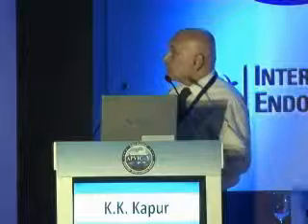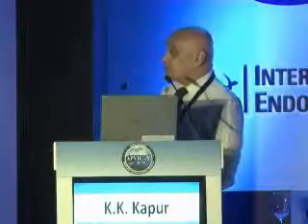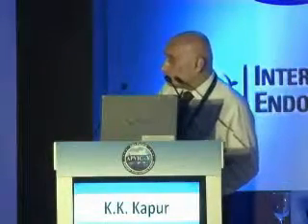is showing venous incompetence at the great saphenous vein at the junction with the common femoral vein. The saphenofemoral junction is severely incompetent. When you do that compression, you get the retrograde flow. Blue is the antegrade flow, but when you apply the Valsalva strain, the vein expands and you get a red flow. So this is a severe form of venous incompetence seen in this patient, and you can see the valves also in this way.